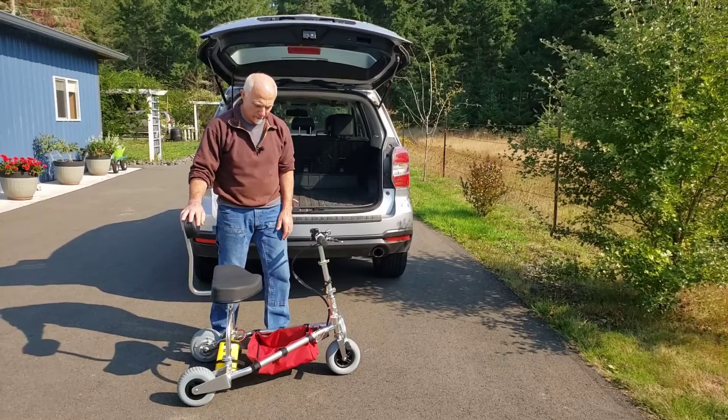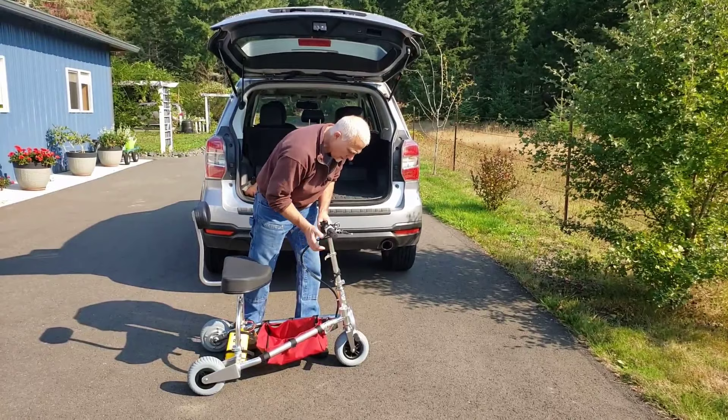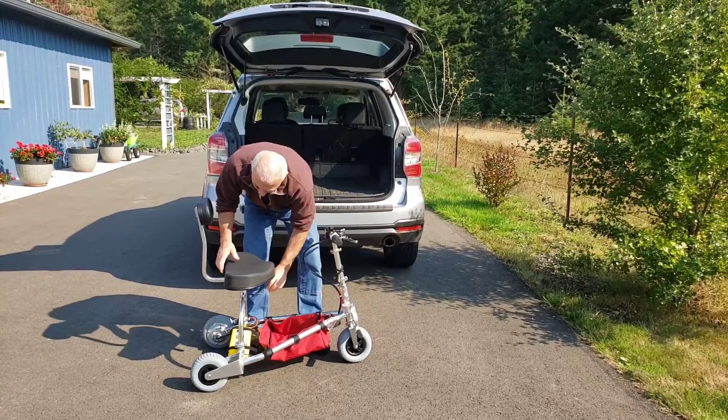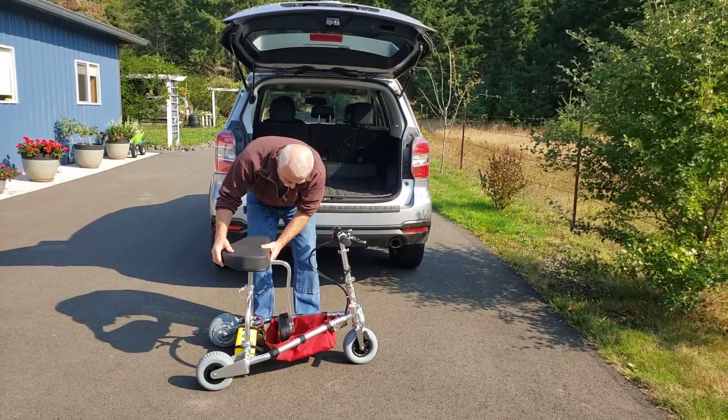In a case such as a hatchback — in this case a Subaru Forester, which is very run-of-the-mill and probably represents the majority of vehicles on US roads — you're not even going to have to go that far. Simply lower the handlebars. This is a very nice little feature on the TravelScoot. By removing the seat, flipping the backrest, and turning the seat around, you now have a single handhold and a low profile. Simply pick up the scooter as is.